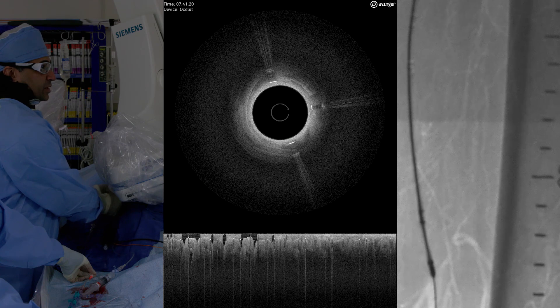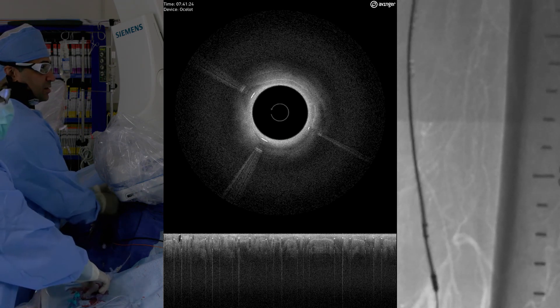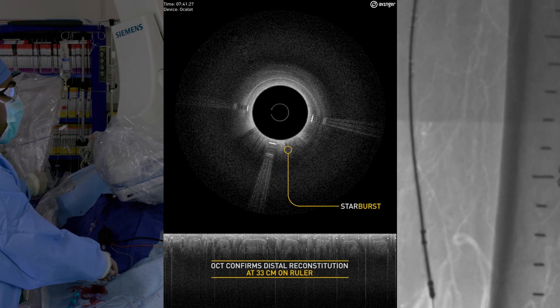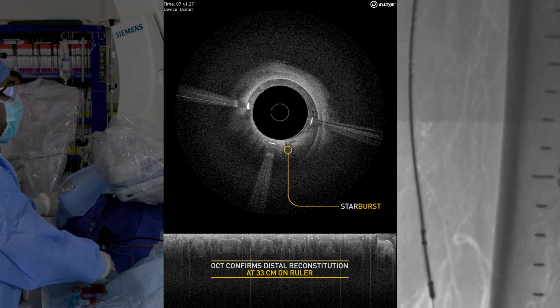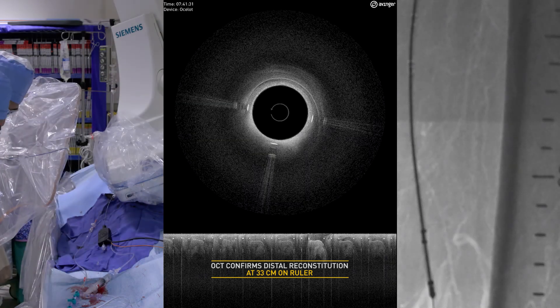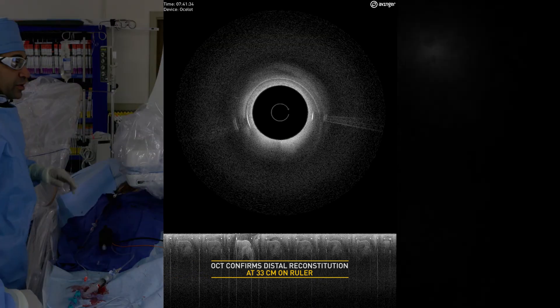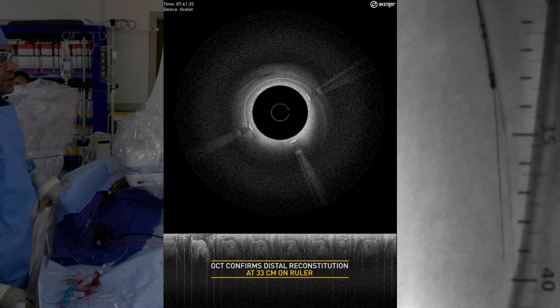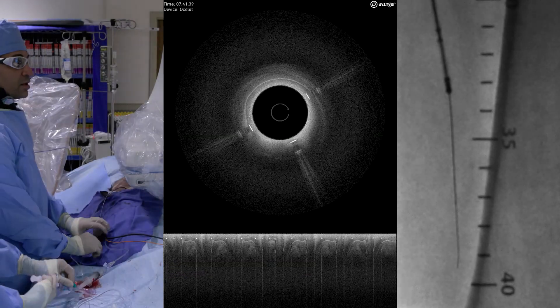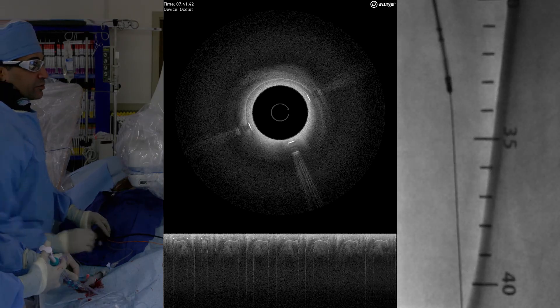It's going nicely. And we should see our starburst here. That's our starburst. We know we're in the true lumen here distally, but we're still not out of trouble. I want to make sure that our wire is going freely before we celebrate. And it is going freely.